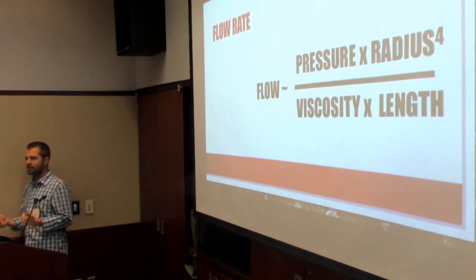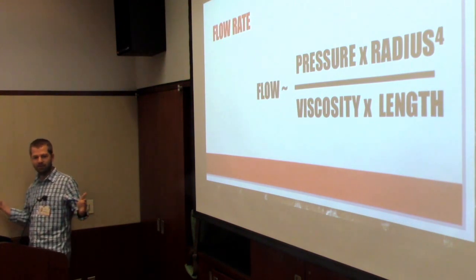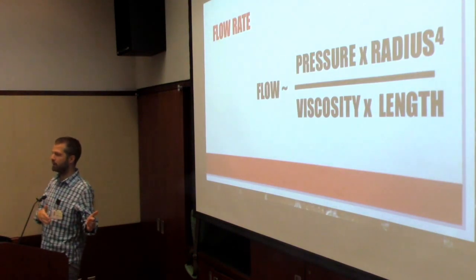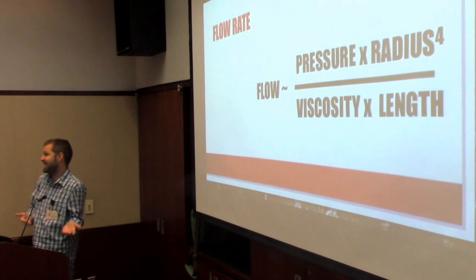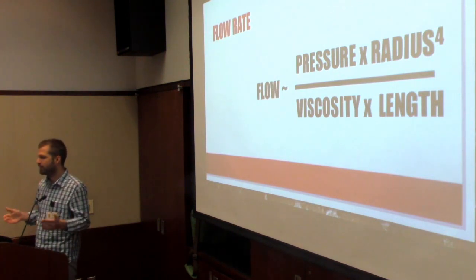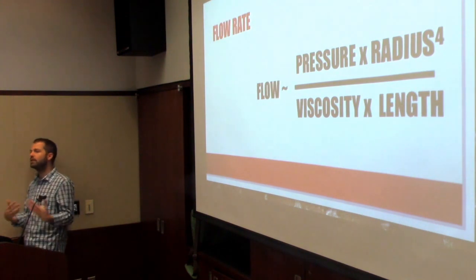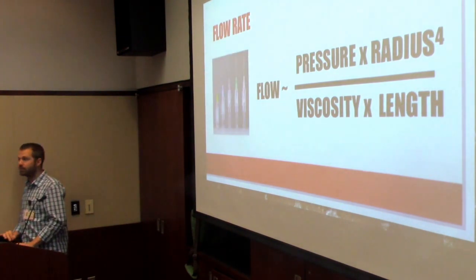And the length. So I put a beautiful sheath in somebody and then I get this 15-foot line of IV tubing to then give them the blood. Kind of just undid all the stuff I did by putting the sheath in. At least there's less resistance, but if you can shorten the tubing, do it. Don't stack lines on top of each other if your goal is to get fluid in quickly. So length is also very relevant another way.